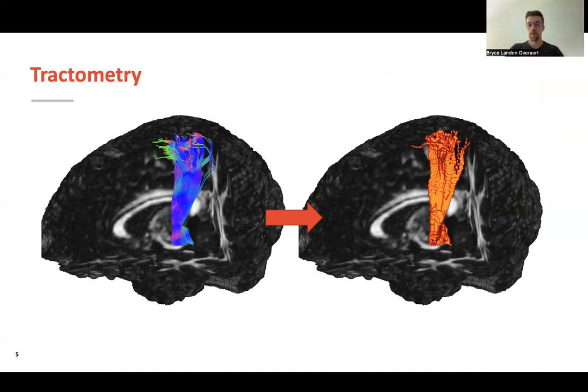But it's worth noting that this one process of taking the corticospinal tract and turning it into a voxel-based mask, and looking at the average structure of that entire tract at once, is a pretty broad approach, and it's only one approach. There are others that are more granular, like analysis along the tract, or tract-based spatial statistics, or voxel-based methods. Lots of other tools out there that are going to augment the findings that I'm talking about today.